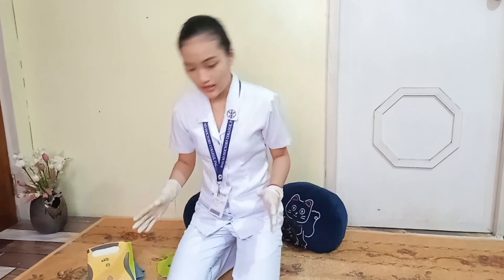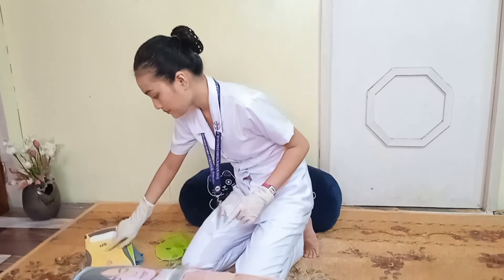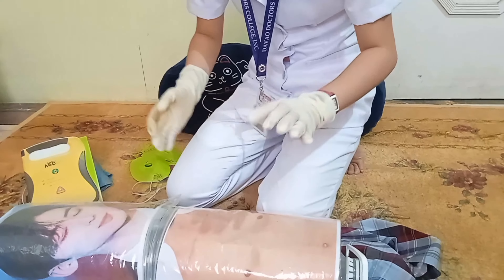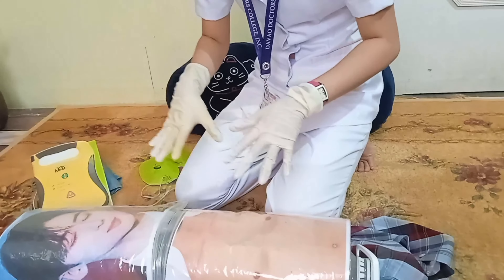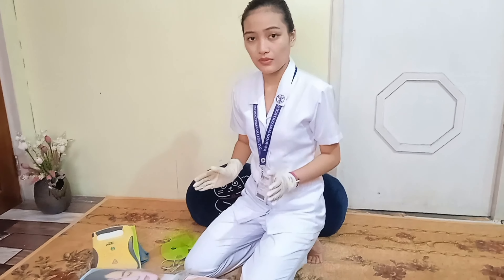Now I am going to proceed with the AED skills. Until the AED arrives, continue doing chest compressions and rescue breaths until the AED is ready to analyze. As the second responder, turn on the AED and quickly scan the patient's chest. If the patient's chest is hairy, quickly trim the areas where the pads will go, because hair acts as a barrier and the AED might not be able to deliver an effective shock. The AED, or automated external defibrillator, is a medical device that analyzes the heart's rhythm and, if necessary, administers an electric shock or defibrillation to help the heart reestablish an effective rhythm.